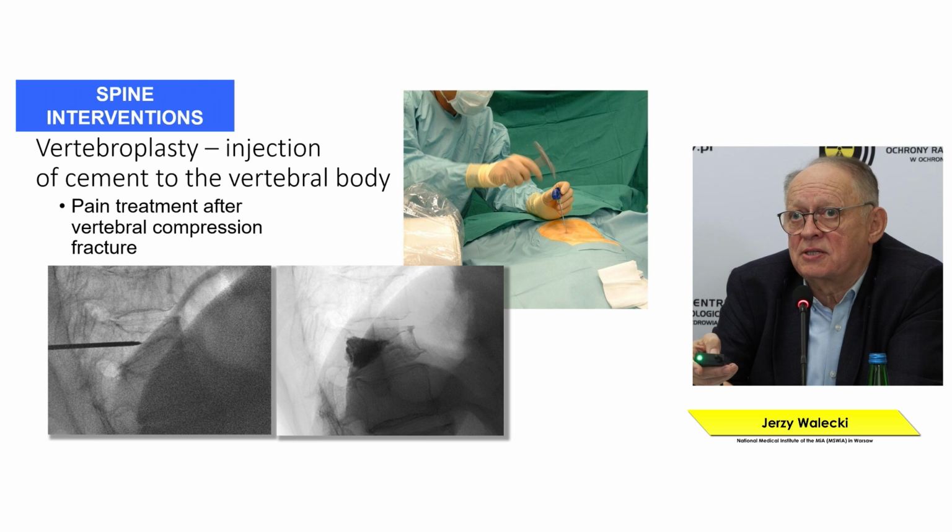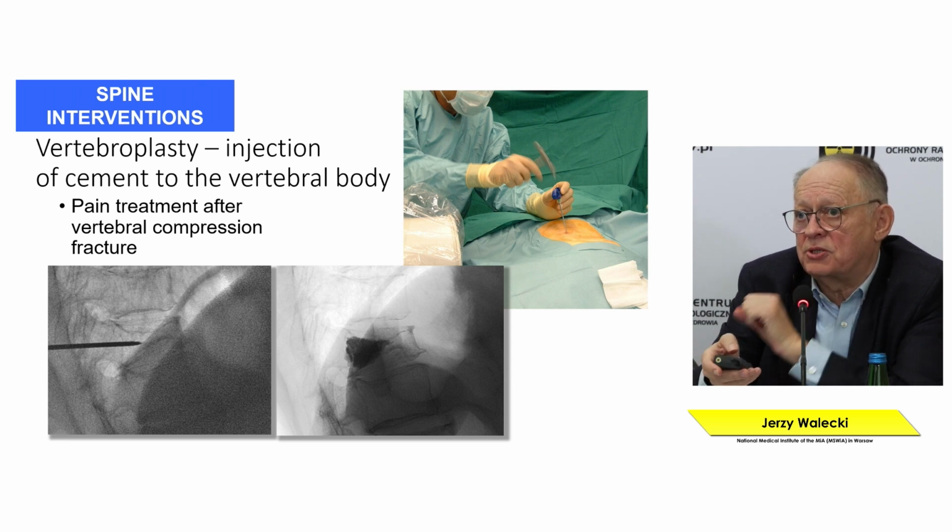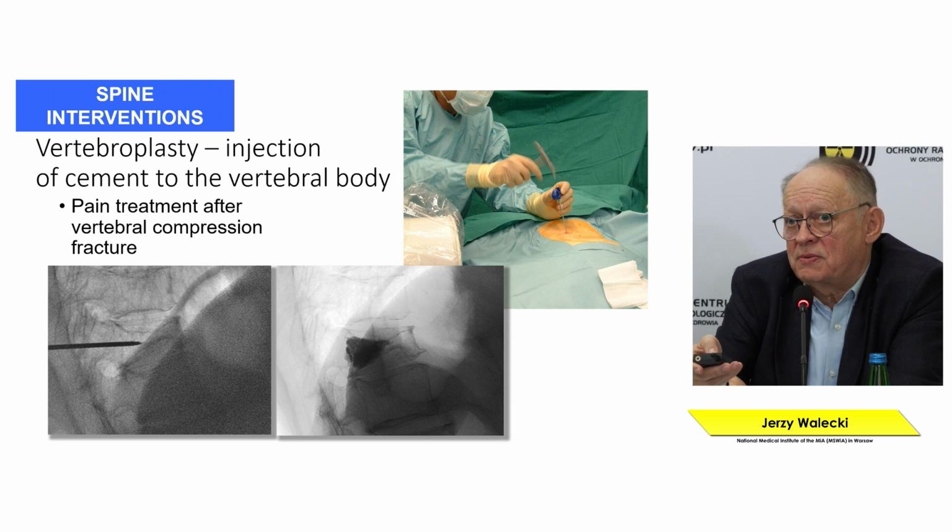This is vertebroplasty treatment. Cement is introduced, and it stops the compression of the fracture.